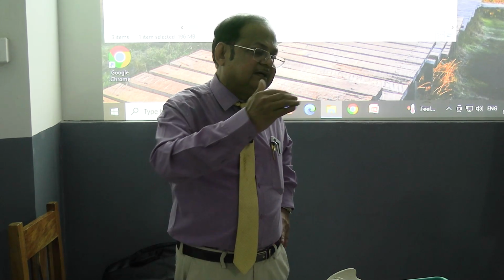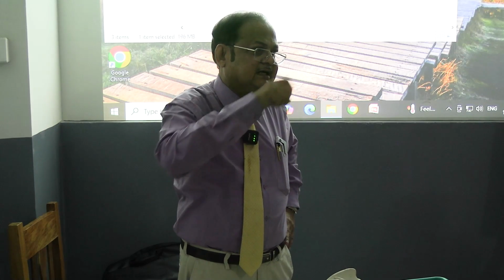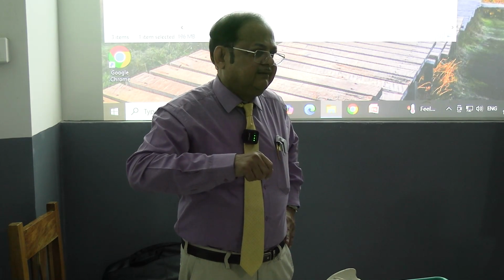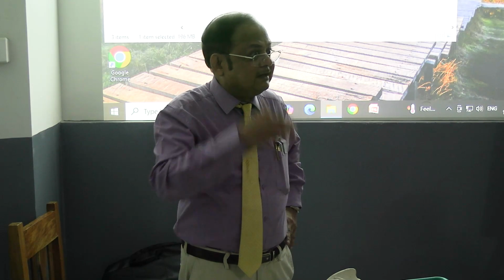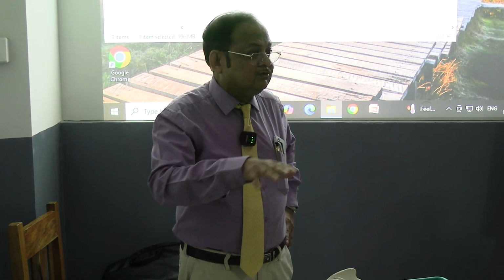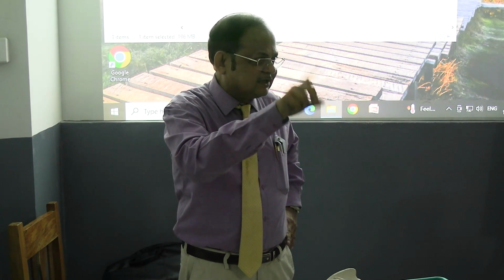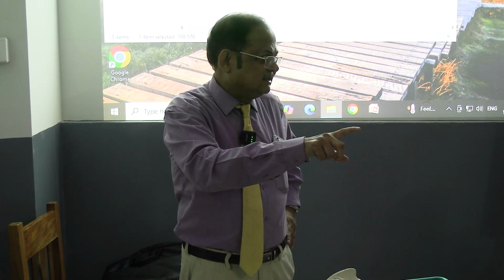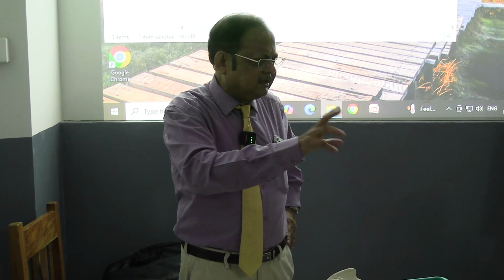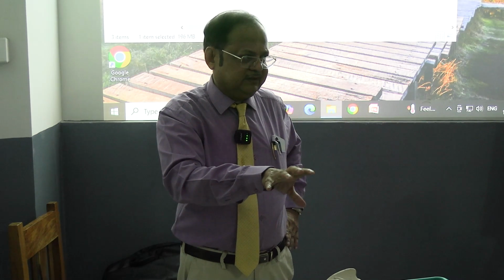Maternal complications means maternal injury, particularly if the cervix is undilated, cervical tear, even lower uterine segment tear, and also vaginal tissue injury. So maternal injury and hemorrhage, even shock may occur. You will see many collections in the book. There is rupture of the uterus following forceps delivery, with an inexpert hand and wrong application, but that is very rare. It should not happen now. That is why a very experienced surgeon should do it.